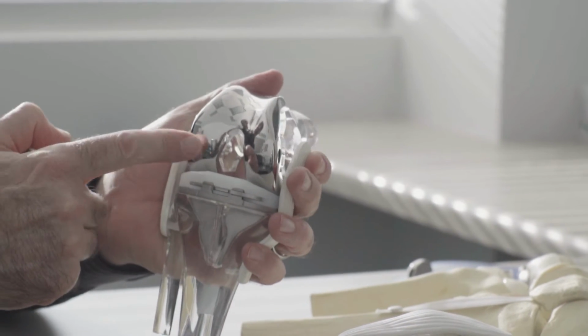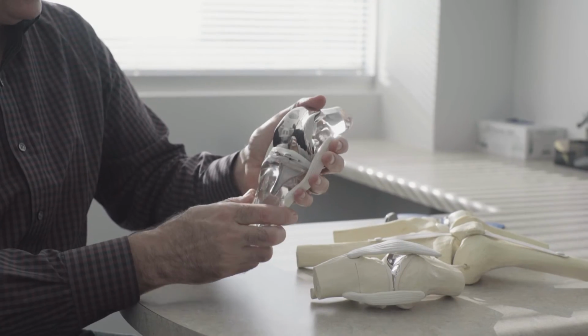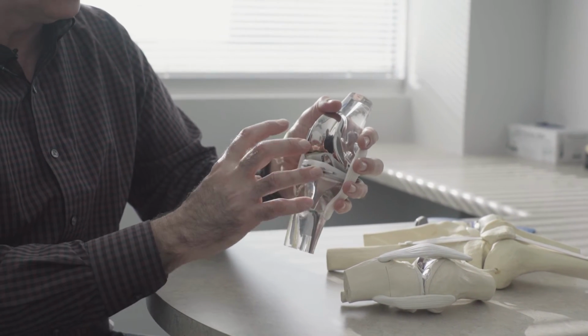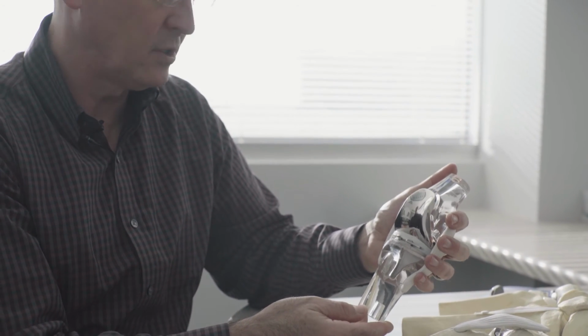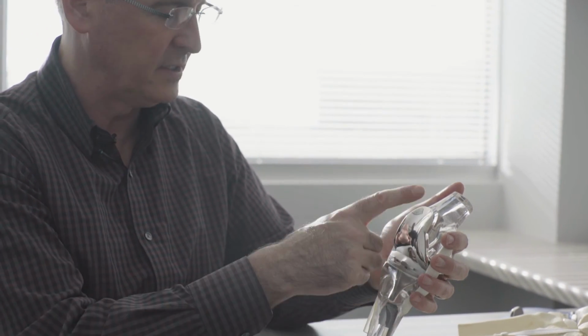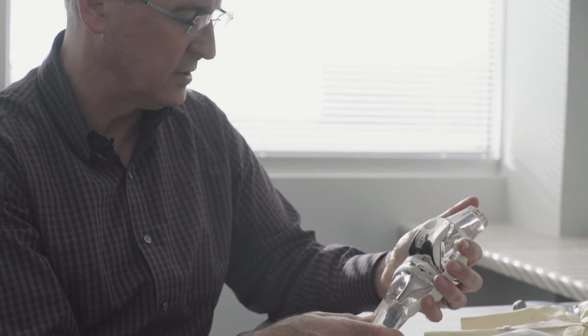The last type of resurfacing is a traditional total knee replacement. What we see here is that the femur is replaced in its entirety, the tibia in its entirety. With this type of surgery, we can restore alignment, we can restore stability, and this would be appropriate in certain situations where all three parts of the knee, the medial, lateral, and patellofemoral, are all affected by degenerative changes.